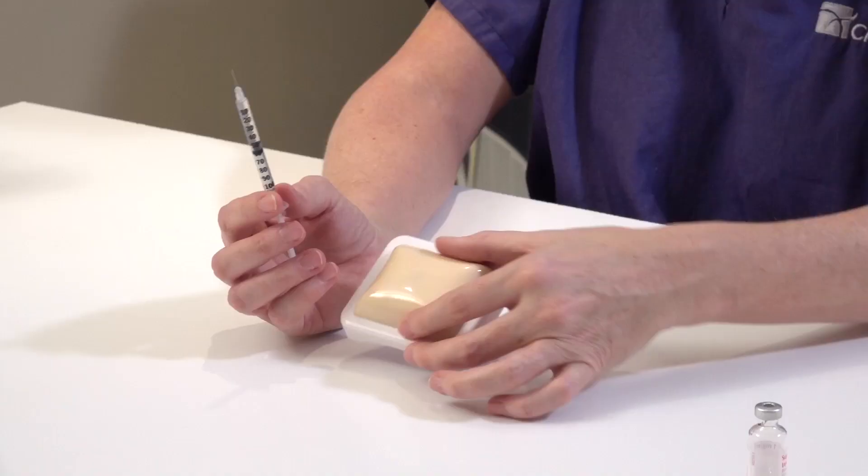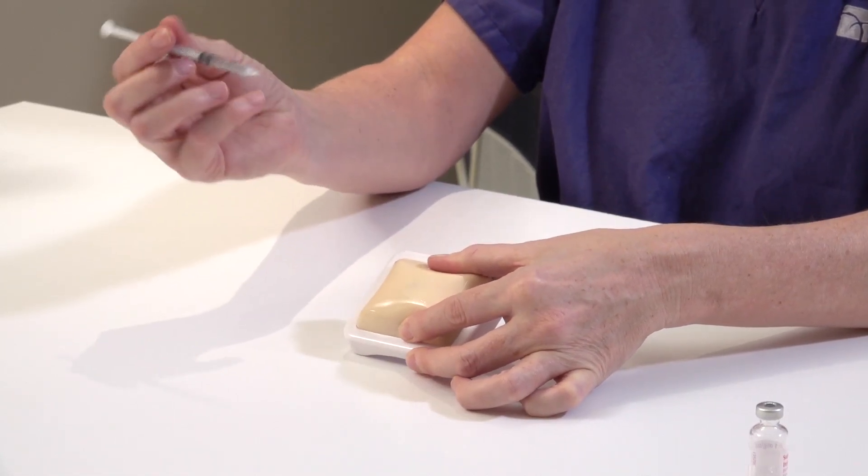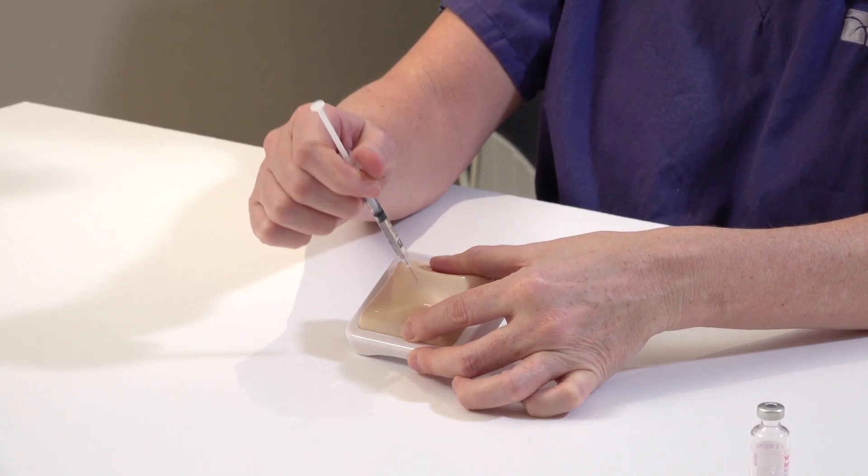To administer Suprecur, we recommend you administer into the abdomen or the top of the thighs. Pinch the skin and insert the needle at a 90 degree angle to the skin.